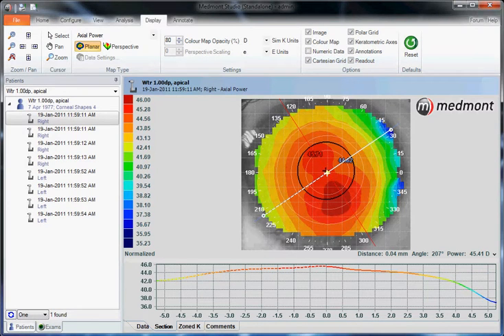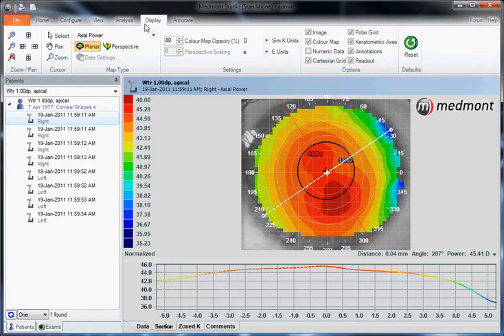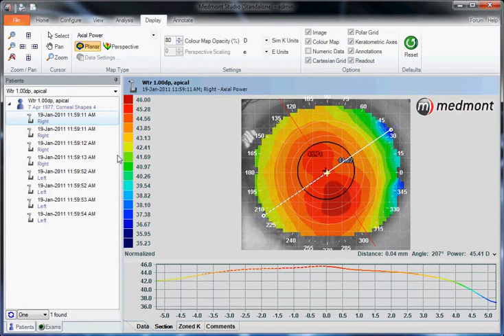This video describes the display tab in your MedMon E300 corneal topographer. Start by clicking on a single topography on the left-hand side, then go up to the display tab. The display tab allows you to alter the appearance of any topography or analysis that you're doing.